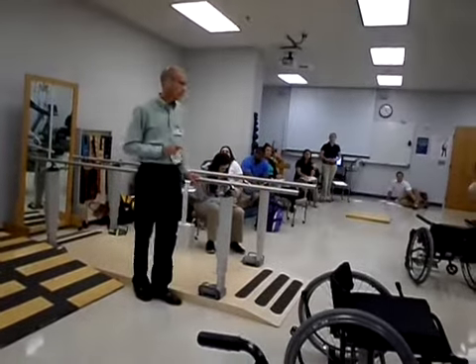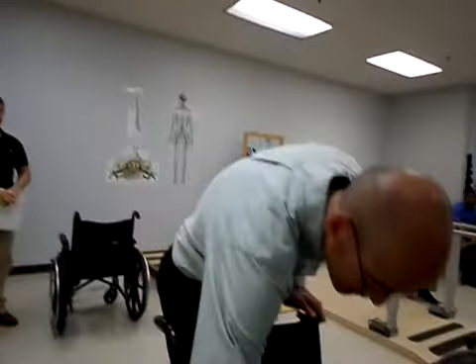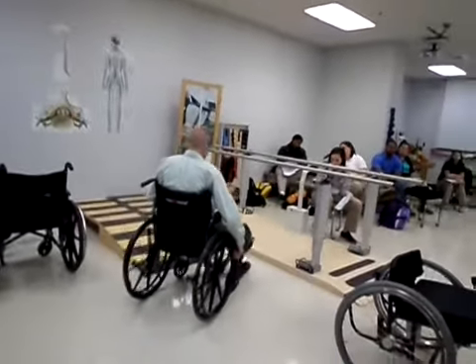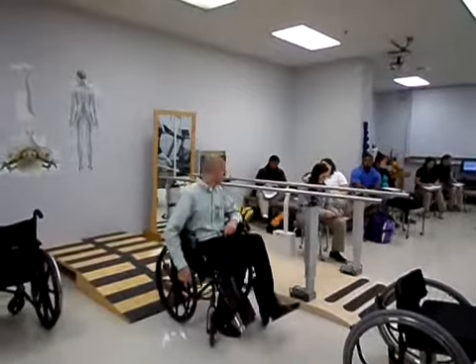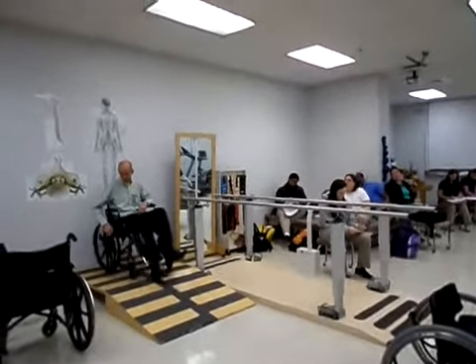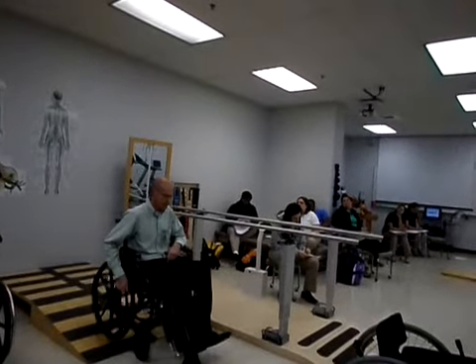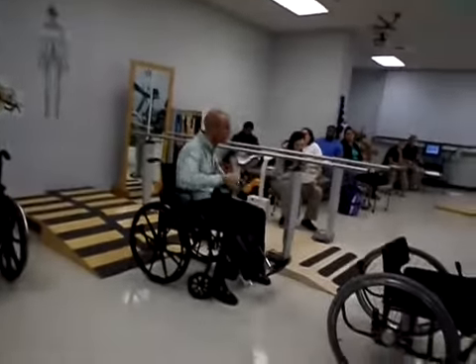So what I'd like to do is, let me show one more thing with the ramp. If somebody had hemiparesis and had to go up a ramp, trying going up backwards would be easier in this case. So this would be kind of a special case. It's almost impossible to try to go forward with just one side working. By going downwards, it would be forward. You can use your hand and your foot to slow yourself down. Otherwise, if you're just in a sports chair, somebody has paraplegia, they'll go up forwards and downwards.